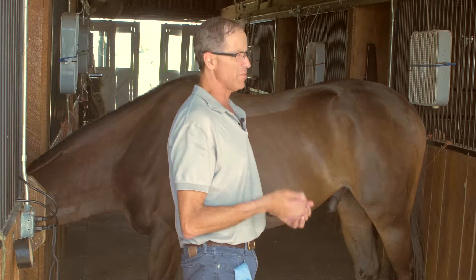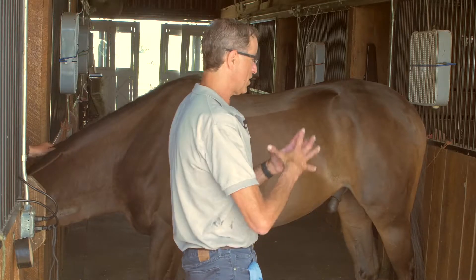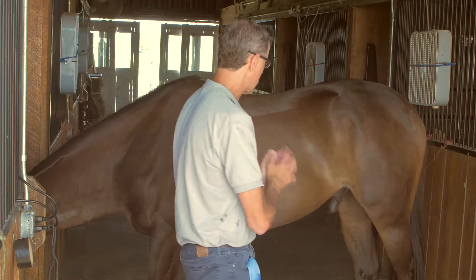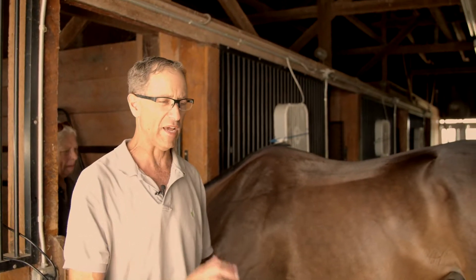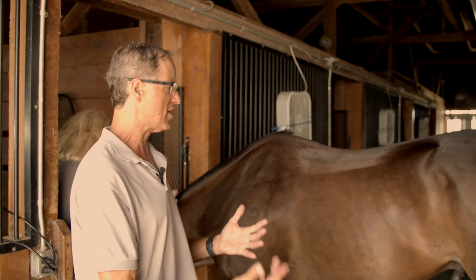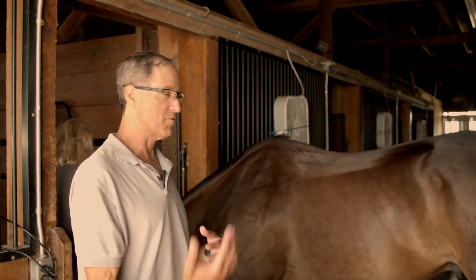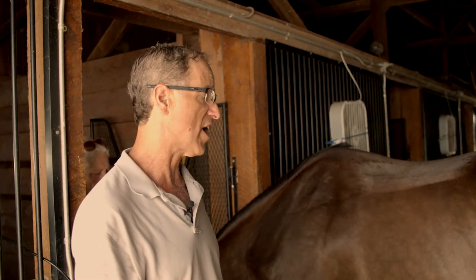This is an area I consider to be extremely significant, and this particular therapy is extremely effective in managing horses that are a bit sore in this area. It's also a very helpful aid in managing an actual injury where you can diagnose a lesion on ultrasound. But a lot of times performance horses get sore in this area but they're not injured, and this therapy helps manage what I call chronic manageable suspensory issues and chronic hock issues.